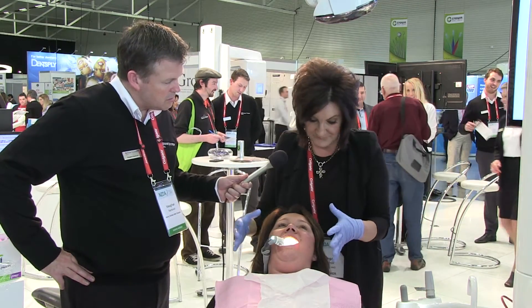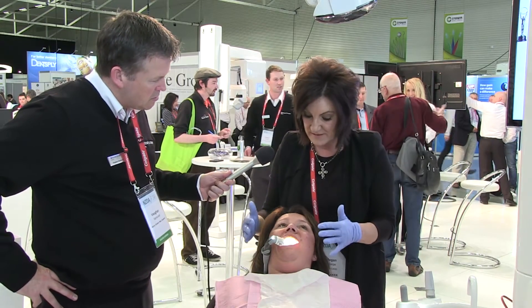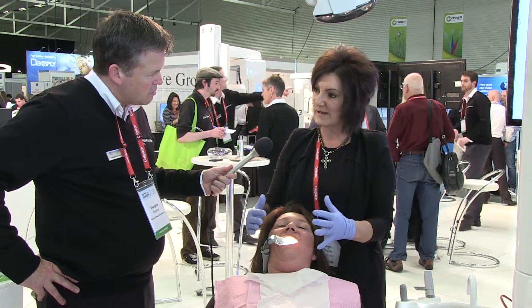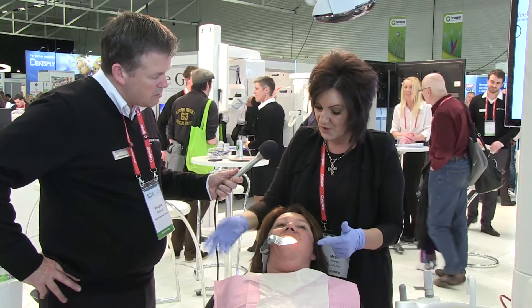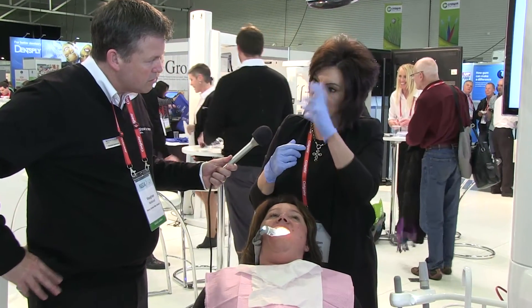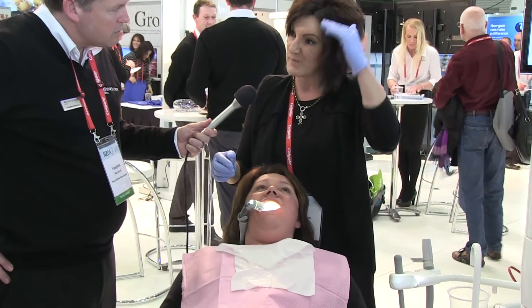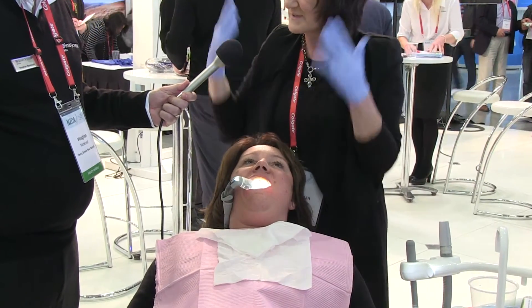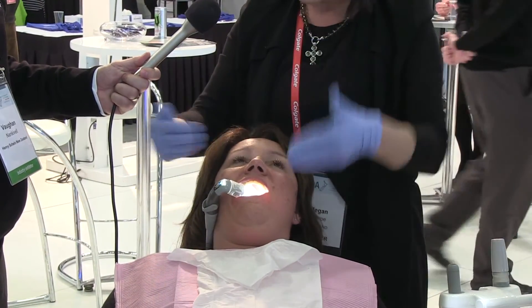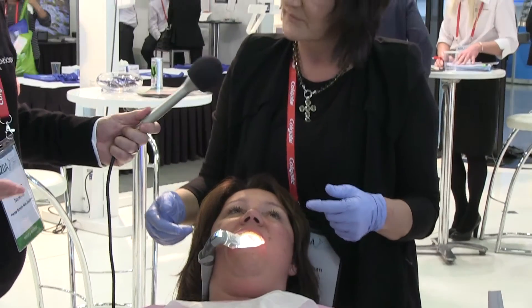Apart from that, it gives full control. If I were seated, I've got control over my neck and my posturing can be improved — I'm not needing to guide my headlight. A lot of dentists will have some kind of magnification and wear a headlight on top of that, which can be quite heavy. With this system the mouth is lit internally, so instead of moving their head into position, the dentist can stay in a static posture, which is really important in terms of ergonomics.